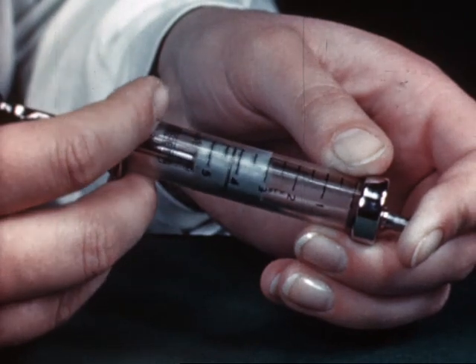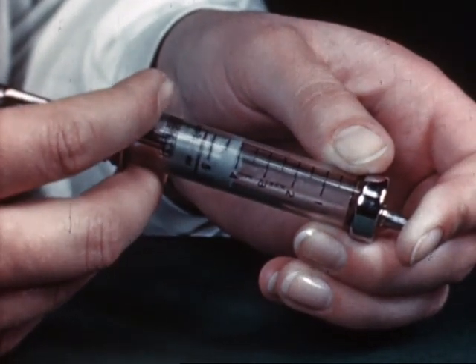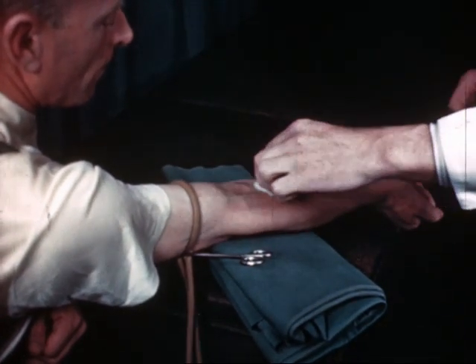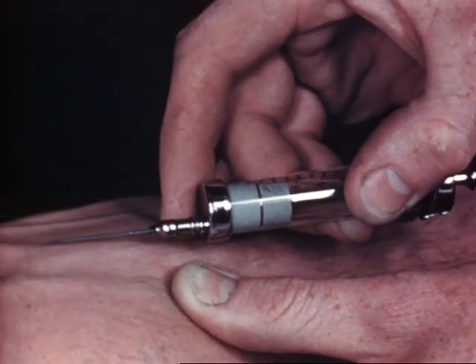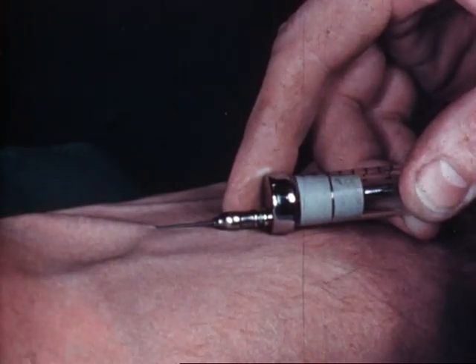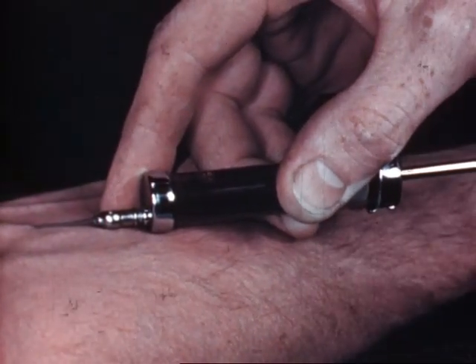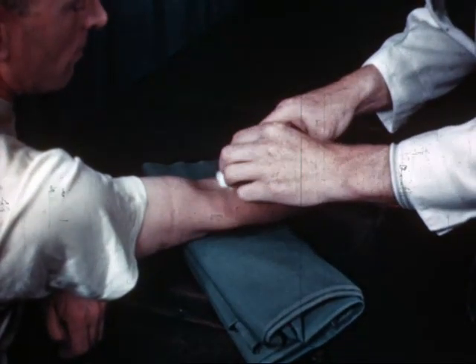Remember then: see your syringe does not leak by testing it. Choose the right needle and make sure it is razor sharp. Extend the arm fully. Choose a good vein. Hold the syringe correctly and firmly, and don't change hands. When you have the amount of blood required, first release the tourniquet, apply a swab, and then remove the needle.